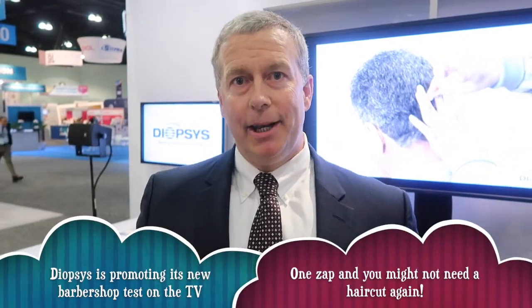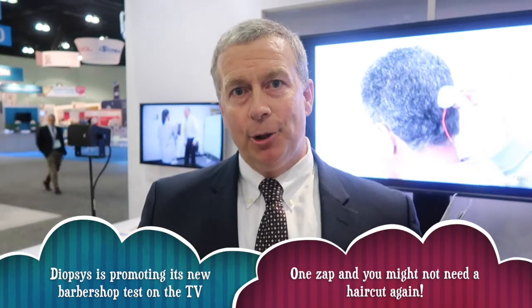A second test is called electroretinography. That specifically tests ganglion cells, so physicians will tell you that'll tell you glaucoma maybe 5, 6, 7 years before, say, a structure test like an OCT, and those are great tests. There's also tests for the photoreceptors now. If you want to look through an opacity, if you're going to do a cataract, you can use a full field electroretinography and test the cone. So maybe a patient has one unhealthy eye and one healthy eye, you can give them an indication before the procedure what to expect afterwards.